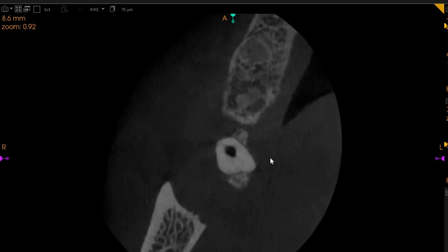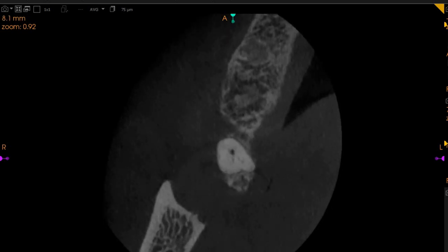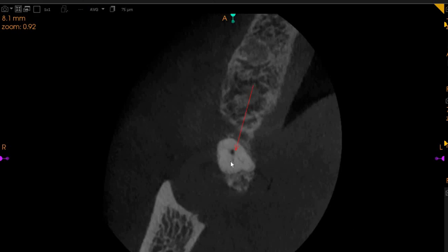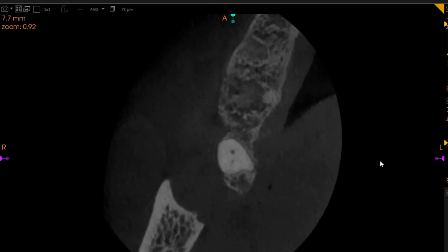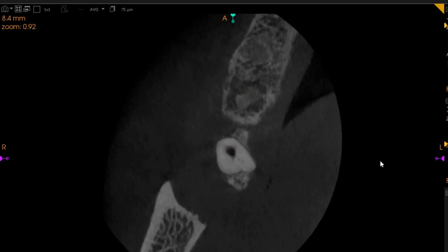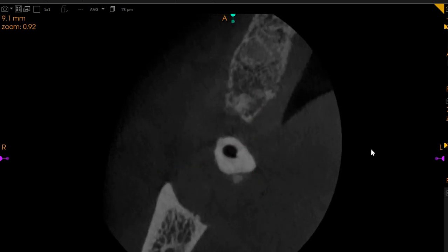As we go further down at the crest, we've got three canals present. One you have found and instrumented — this is the mesio-buccal, this is the disto-buccal, and this is the palatal. So all three canals are present. The mesio-buccal is slightly wider, whereas the disto-buccal and the palatal are slightly narrower.